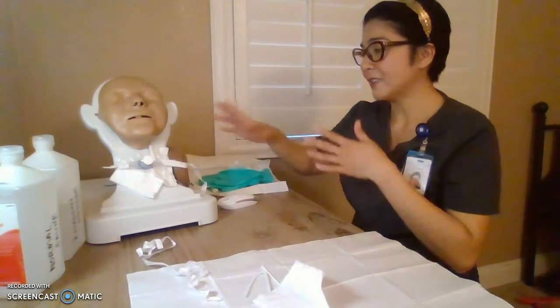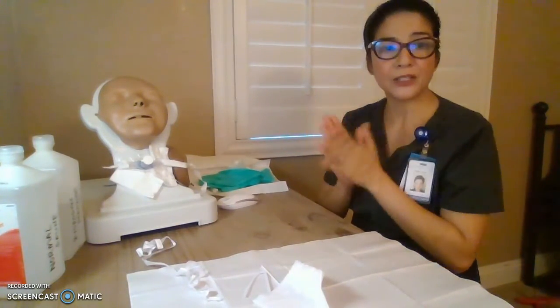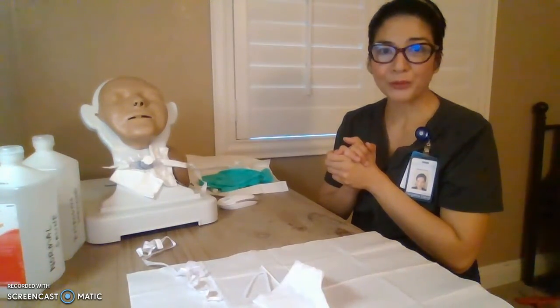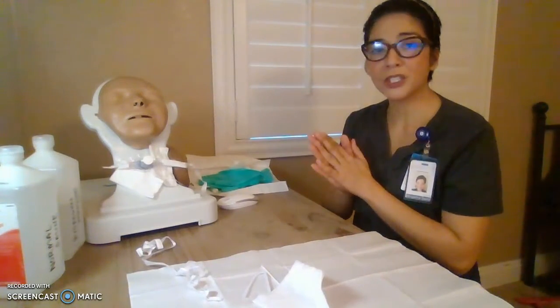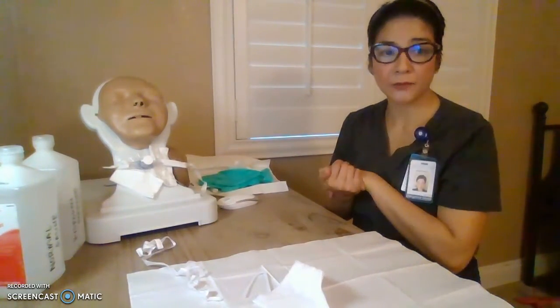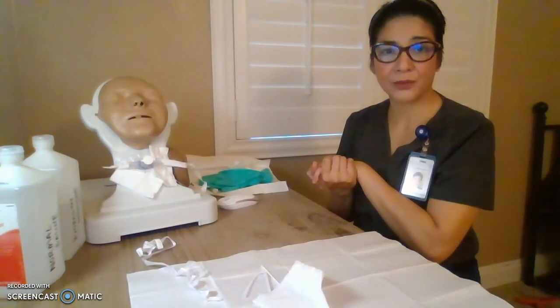So that is it. Hand hygiene after removing your gloves. Don't forget, and after procedure as well. And then document on everything that has happened throughout the whole procedure. Make sure your patient is safe, good height, bed in lowest position, call light within reach, reorient your patient on the use of call light, and also bedside table within the patient's reach as well.